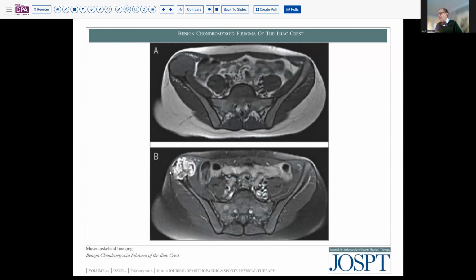Here's the MRI, which shows again this sort of fluid-rich or abundant loose myxoid tissue characteristic of these lesions. I had to take this from a website and so forth. It's not from our patient per se. But it does not have fat in it. It's not normal fatty marrow, where you can see here the marrow changes are more fatty. This has more fluid and tissue density.